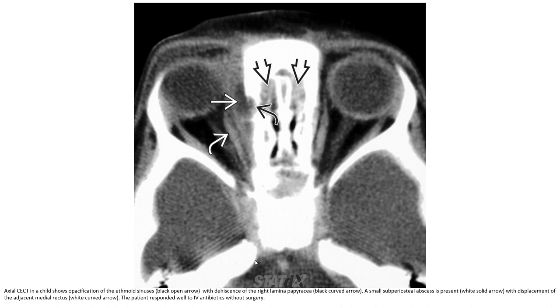This is again axial CT in a child showing opacification of the ethmoid sinus with dehiscence of the right lamina papyracea. A small subperiosteal abscess is present with displacement of the adjacent medial rectus muscle. The patient responded well to IV antibiotics without surgery.